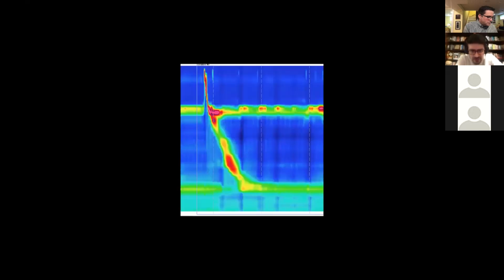But as Rob mentioned, sometime in the past 15 years, high resolution manometry popped along, and you have these much more eloquent images to really look at esophageal motility.